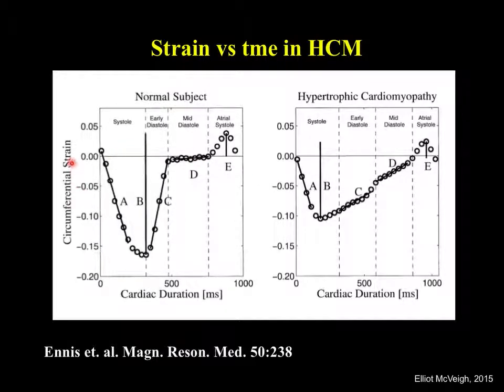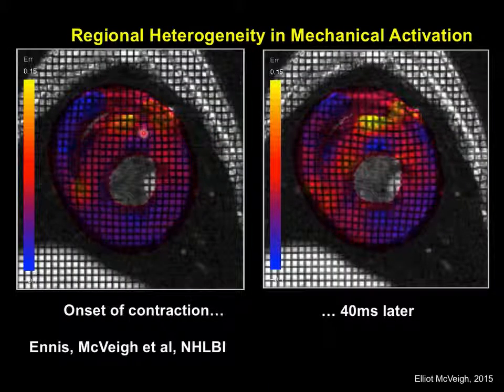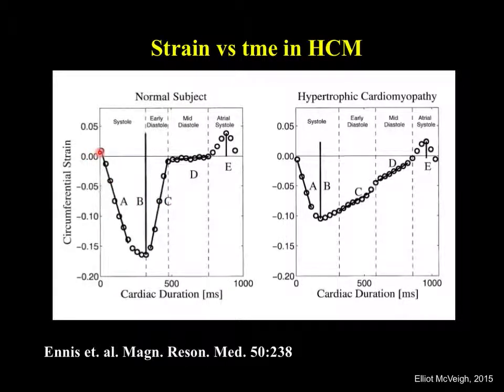If you plot the circumferential strain, or the circumferential shortening, so if I look at each box and measure how it gets shorter in this direction, in that loop direction, this shows over time during systole it gets, say, 15 or 18% shorter over time to end systole. Then it opens up when we're refilling the ventricle. This is diastasis. And then atrial kick opens the heart more, right?